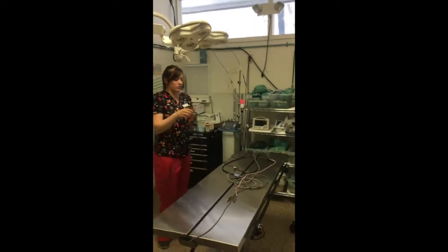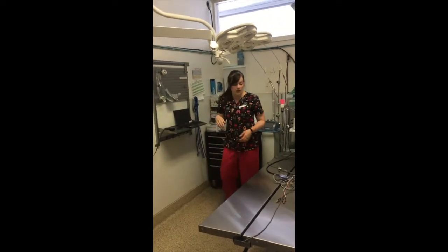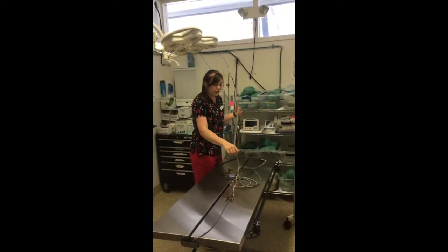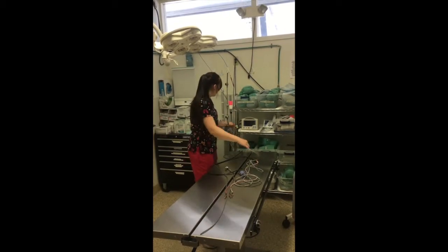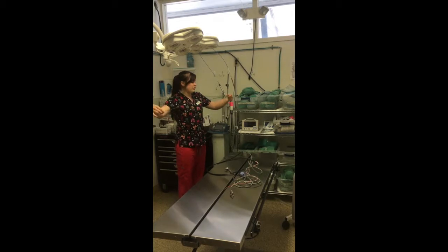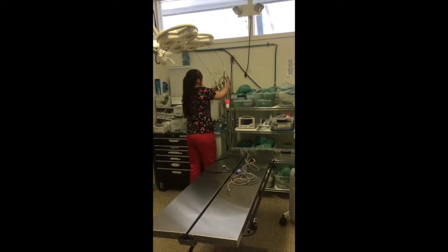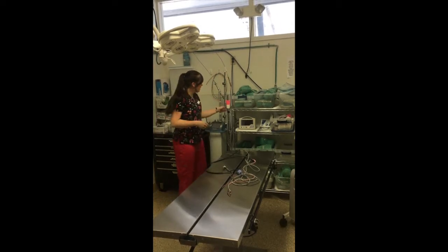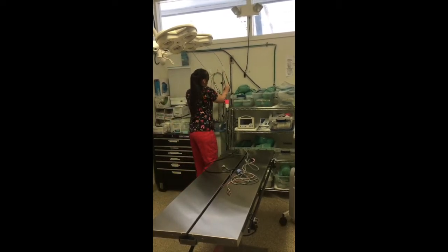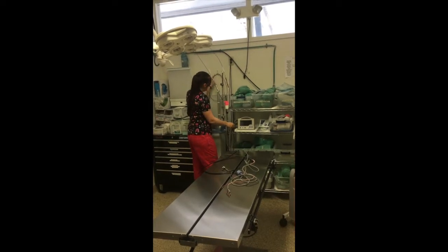So we just hang these on the wall so they're out of the way and easily accessible for the next day that we set up surgeries. So I'm going to go ahead and start hanging up our monitoring equipment. We always want to make sure that we put the monitoring equipment away really loose. If you put it away too tight, sometimes it can damage the equipment, and we don't want to do that. So we hang those out of the way.